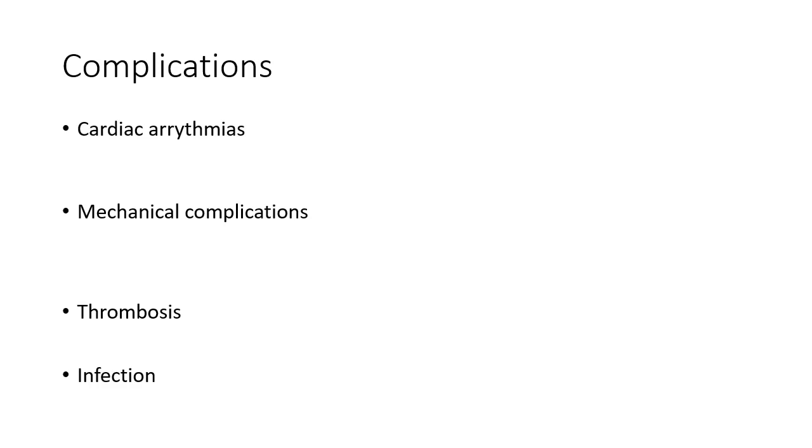So quickly, what are some complications? Note that you may have some cardiac arrhythmias. These are usually transient as you're placing the PA catheter. If you see them, don't futz around, just keep going. And they should pass as you get into the PA.